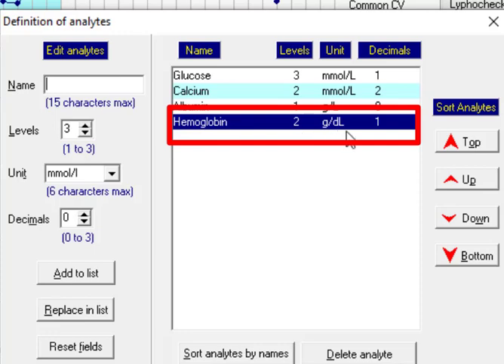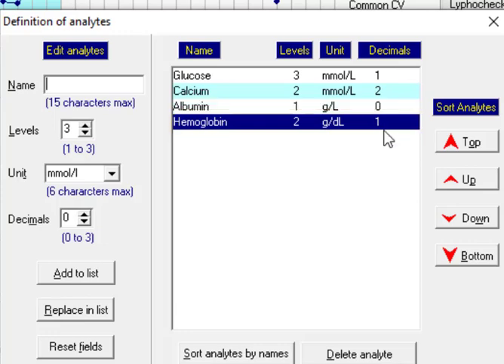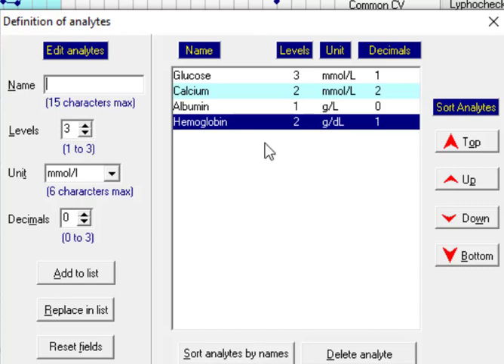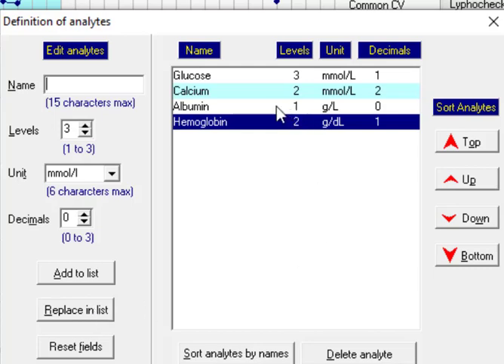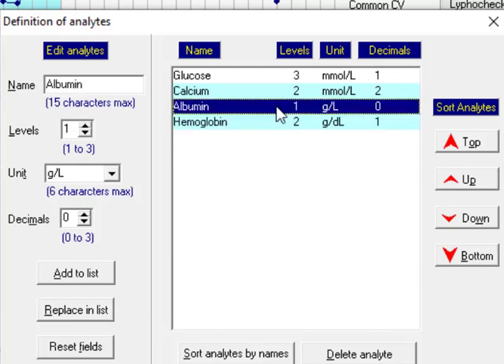This is the list of analytes. After defining a new one or by using replace in list we can edit one of them. For example, albumin, after clicking on it the data is shown here.